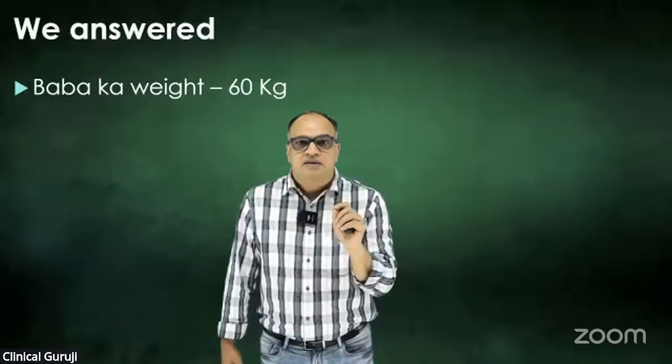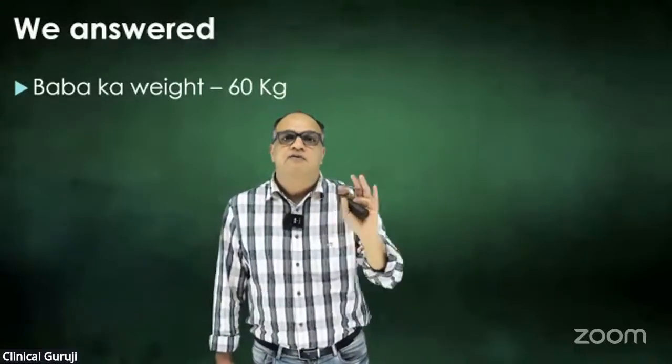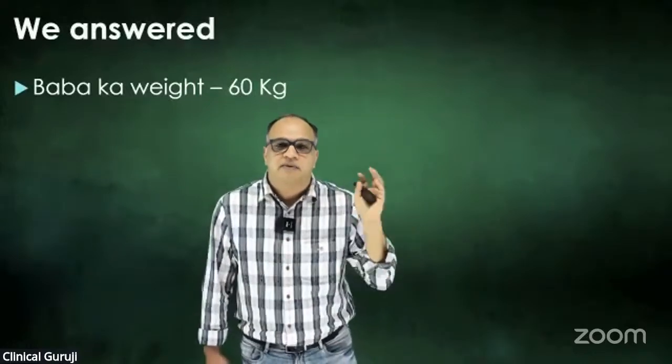So this guy is kind of unconscious. And what we need is, we need to remove his CO2. We want to wash off all his CO2. And to wash off his CO2, we need to give a fixed minute ventilation, because CO2 depends only and only on one thing, that is minute ventilation. So we need to give him a fixed minute ventilation.